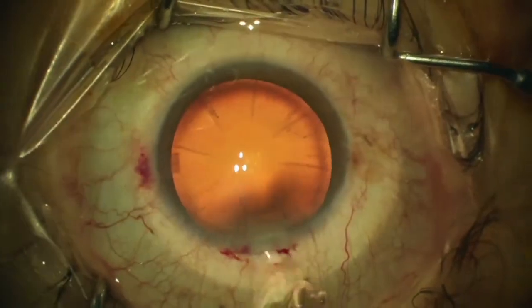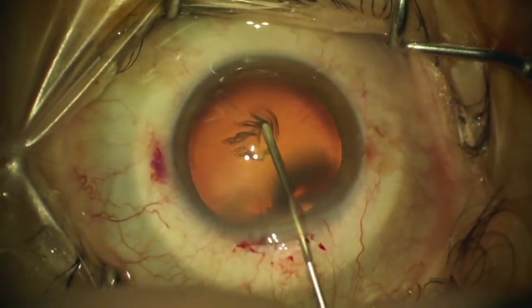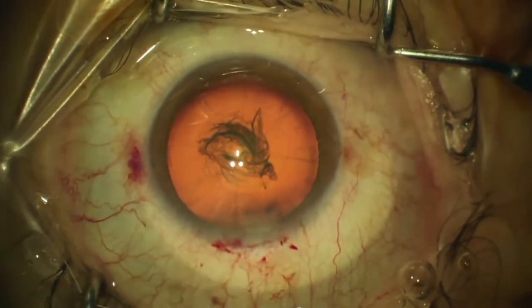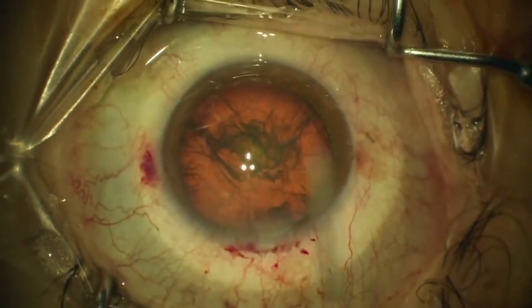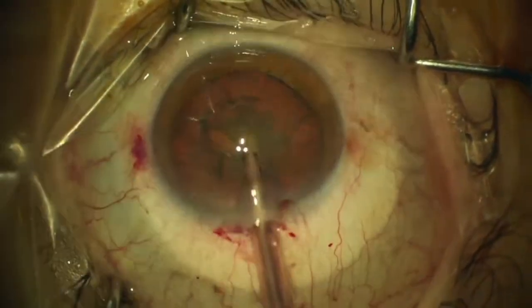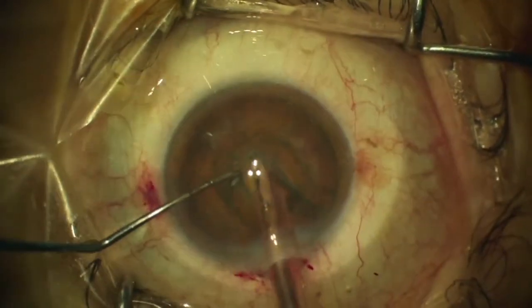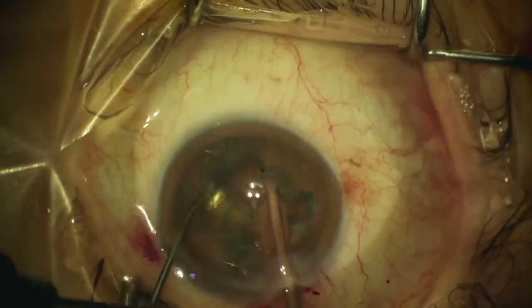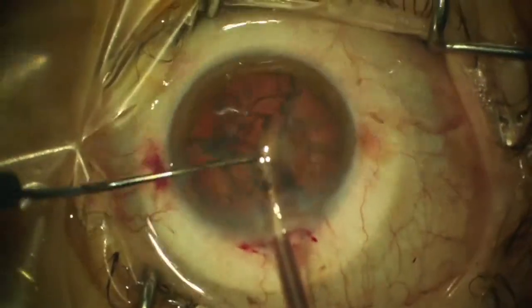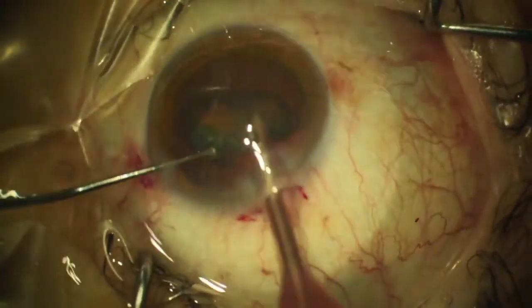From here on the phaco procedure is just as usual, with capsulorhexis aiming for a 5 mm diameter, followed by hydrodissection and viscomobilization of the nucleus. I usually divide the nucleus into three pieces. The phaco machine used in this case is the Centurion from Alcon with Ozil IP, with active fluidics set at 40 mmHg. You can see how stable and calm the anterior chamber remains during the emulsification process.